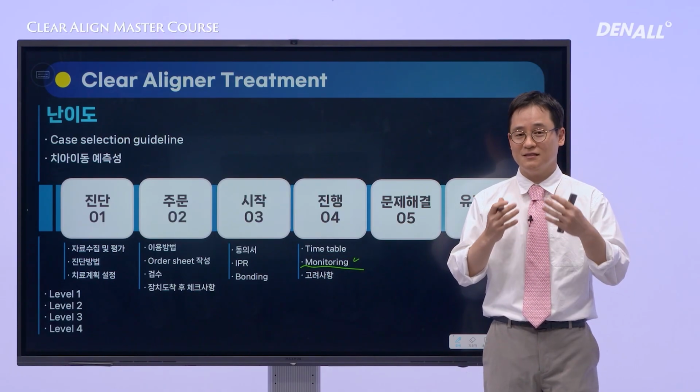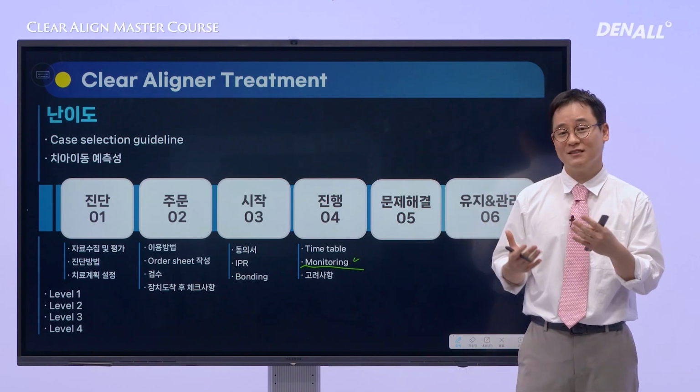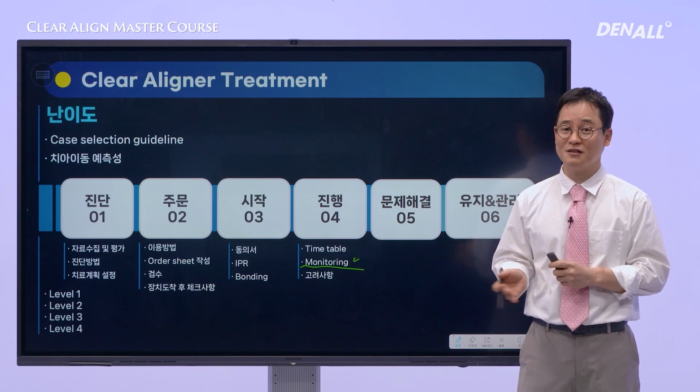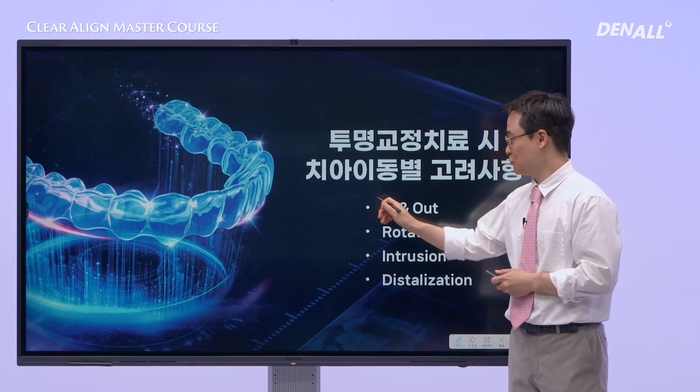You might be wondering about what this refers to. After delivering the aligners, the patient begins their regular follow-up visits. In this session, I'd like to talk about what we need to check during this stage.